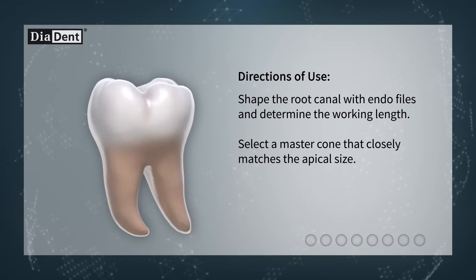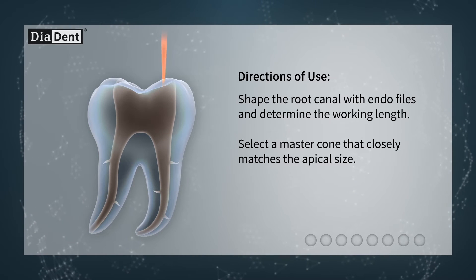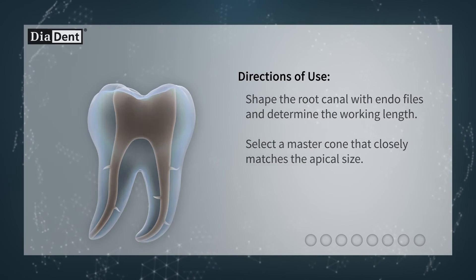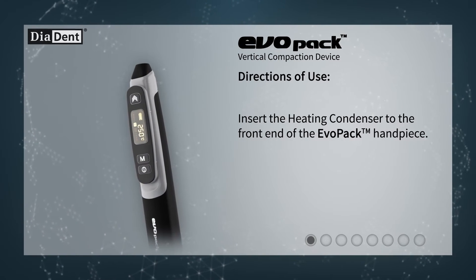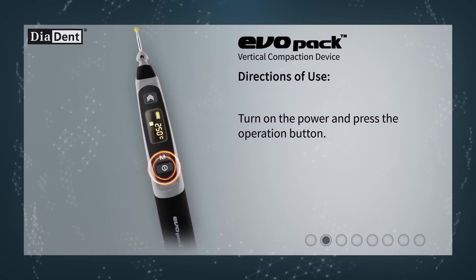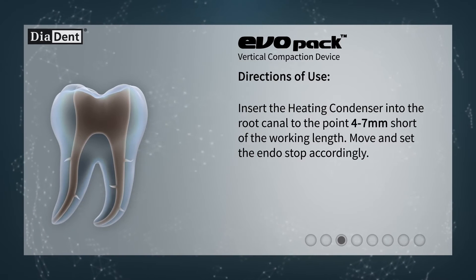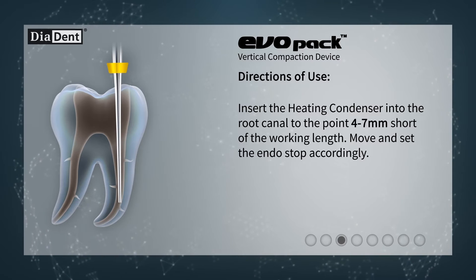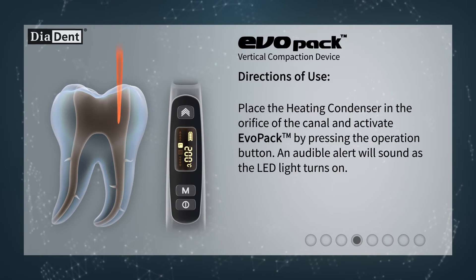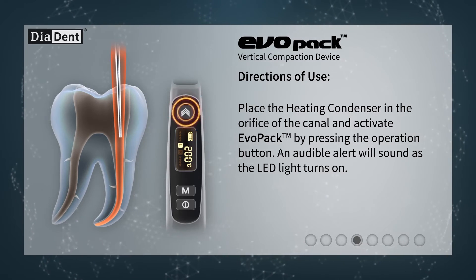Directions of use. Shape the root canal with endofiles and determine the working length. Select a master cone that closely matches the apical size. Insert the heating condenser to the front end of the Evopack handpiece. Turn on the power and press the operation button. Insert the heating condenser into the root canal to the point 4 to 7 millimeters short of the working length. Move and set the endo stop accordingly.